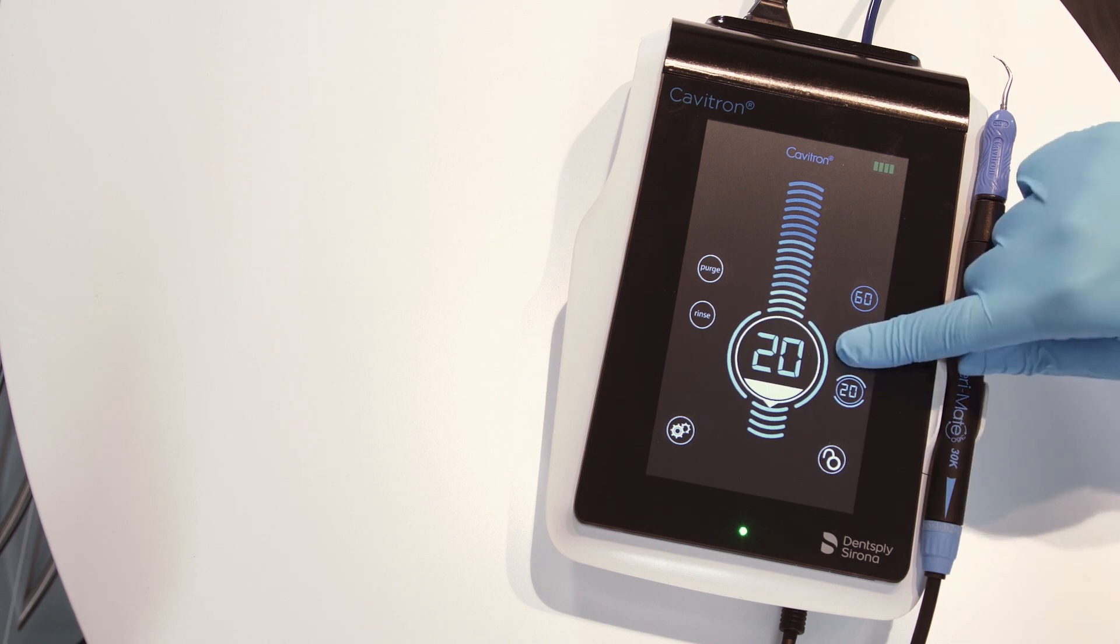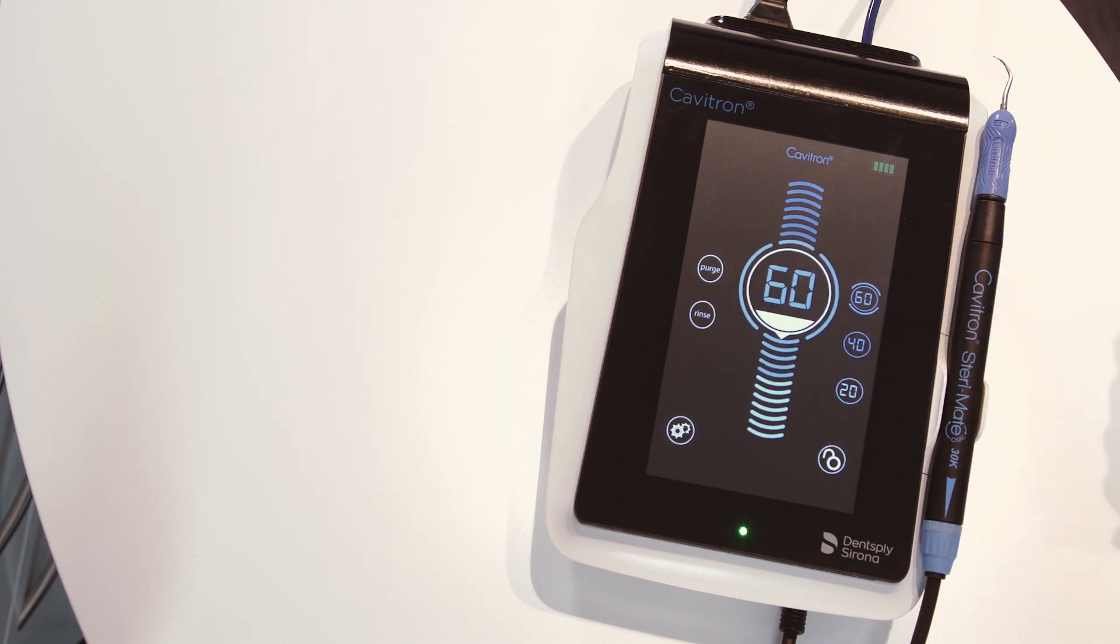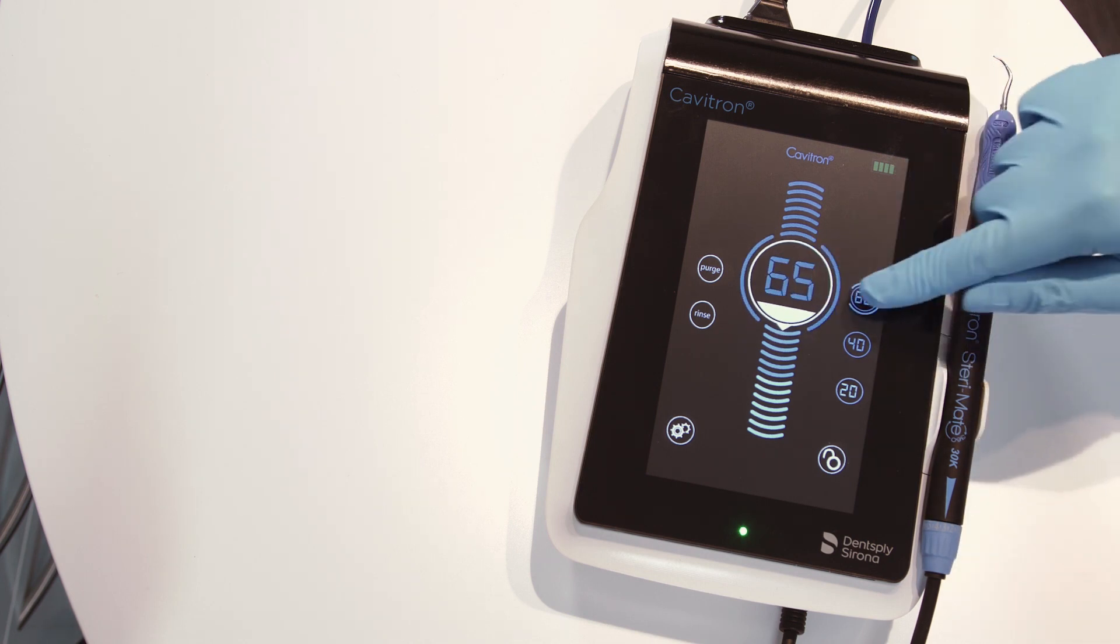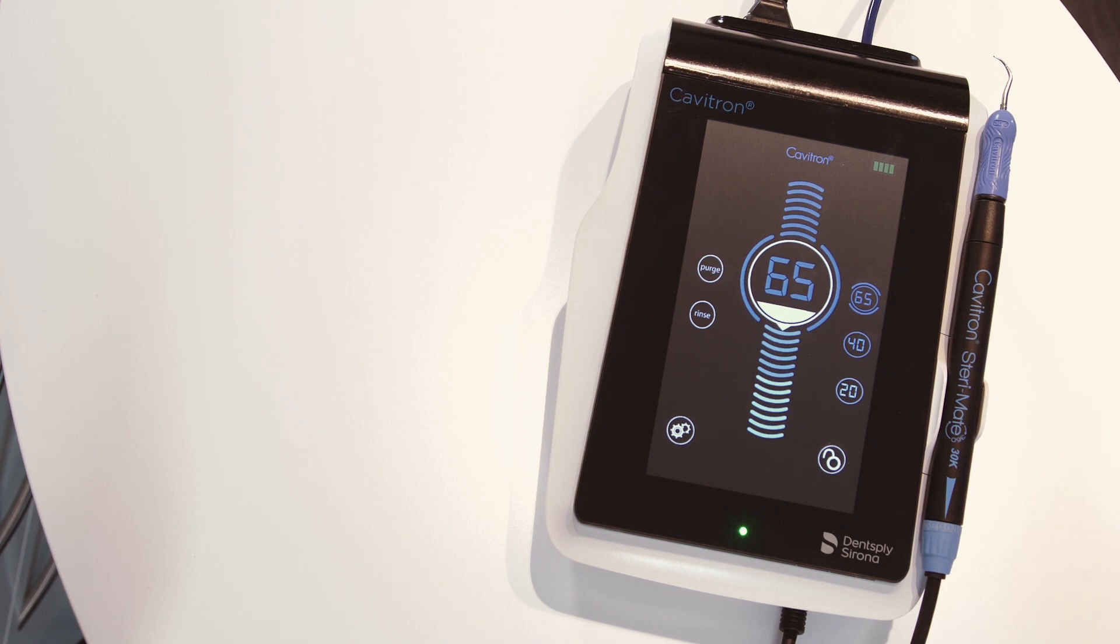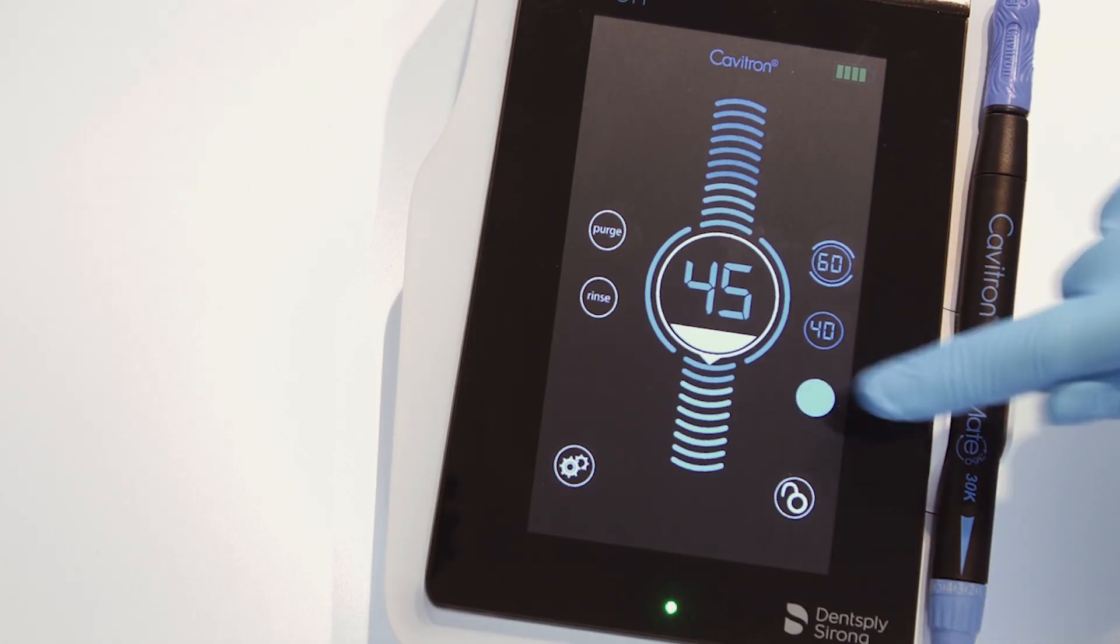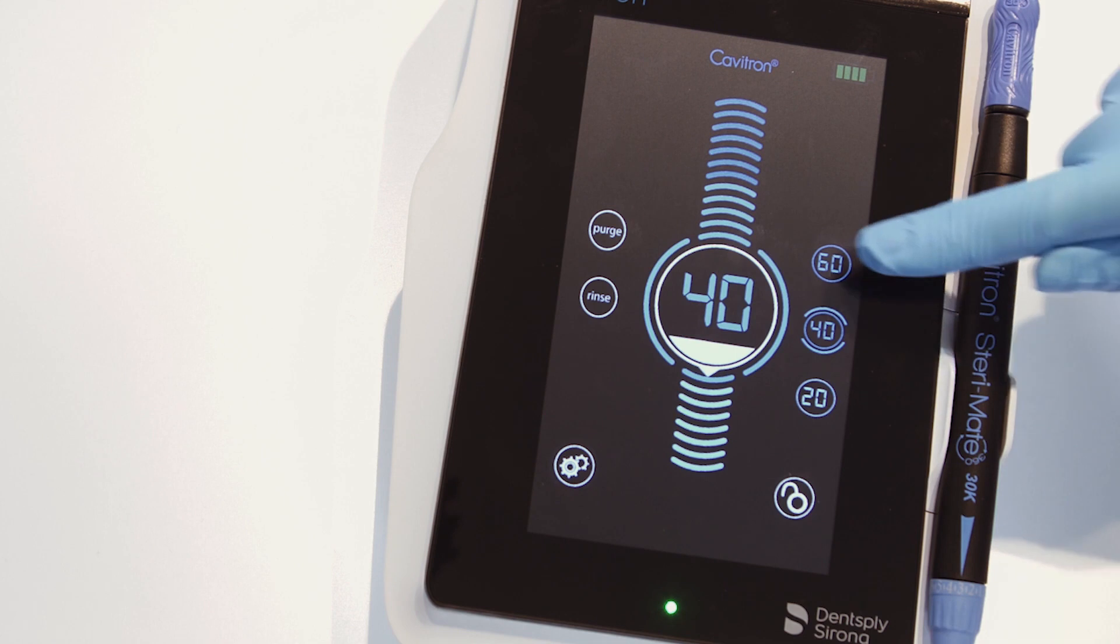The user can adjust the power level for increased power. Three power preset options are available. Please adjust the power level to your desired output, and press and hold the preset button until the sound indicator is heard to reset. The factory setting for the presets are 20, 40, 60.